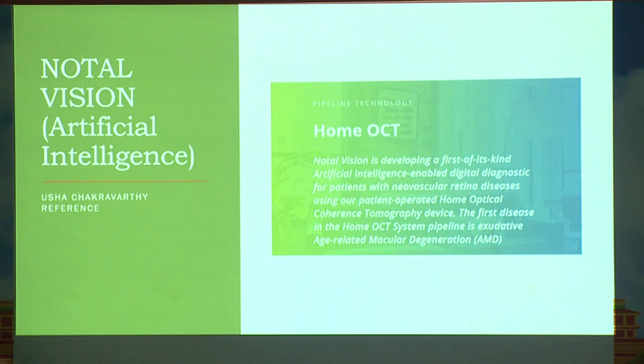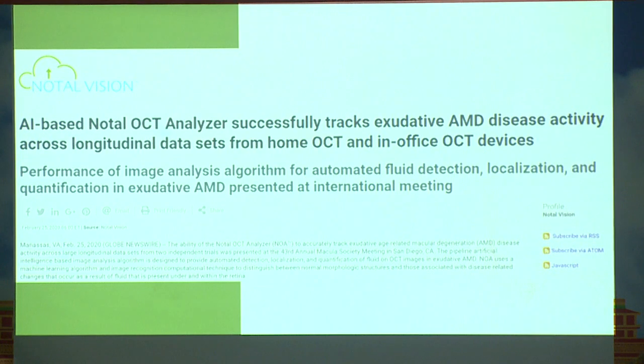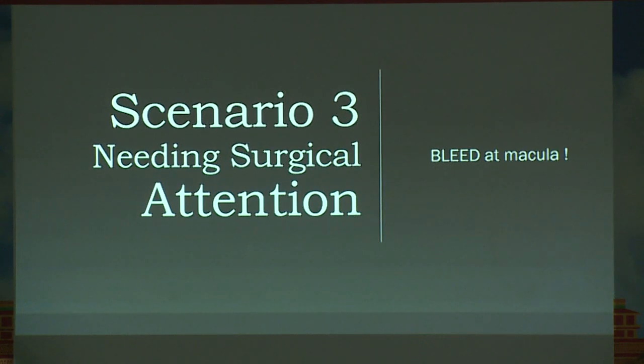So these are the advantages of having the artificial intelligence in your home as well. Now this was very nicely published: AI Notal Analyzer successfully tracks exudative AMD disease activity. Now coming to the last scenario, scenario 3, which needs surgical attention.